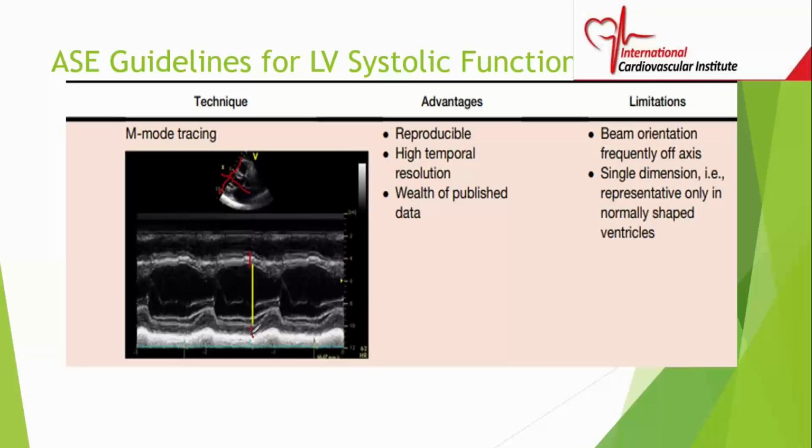They didn't show you the systolic measurement, but at the lowest point, you drop a perpendicular straight down, and this will be your systolic measurement. Usually, as you know, diastole is the widest diameter. Systole should be the smallest diameter.